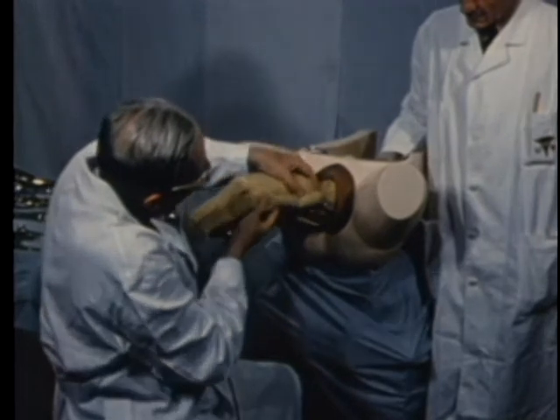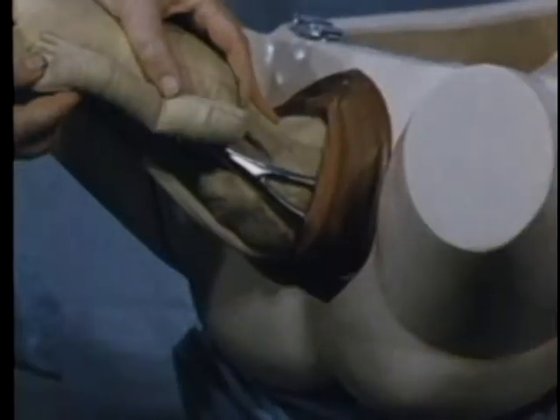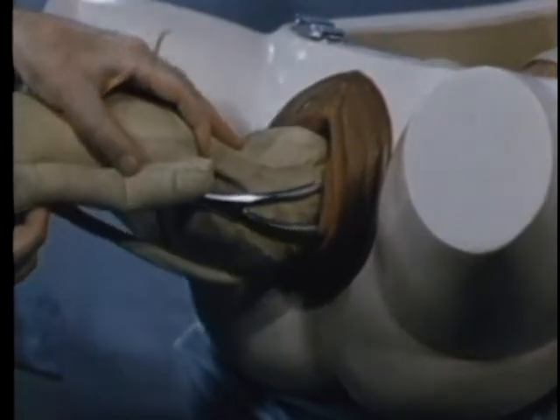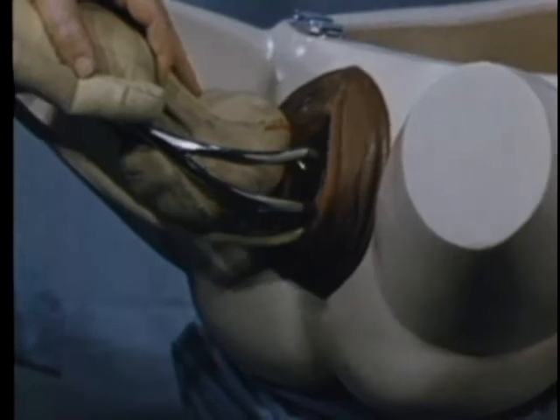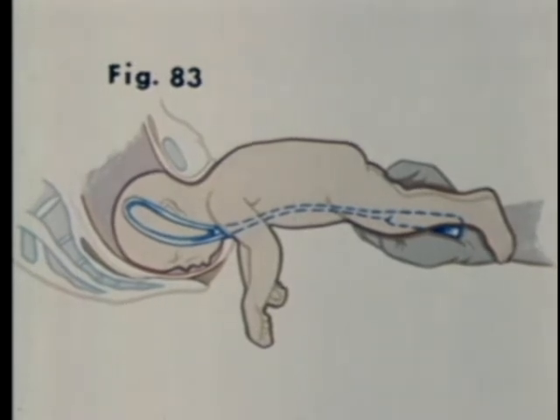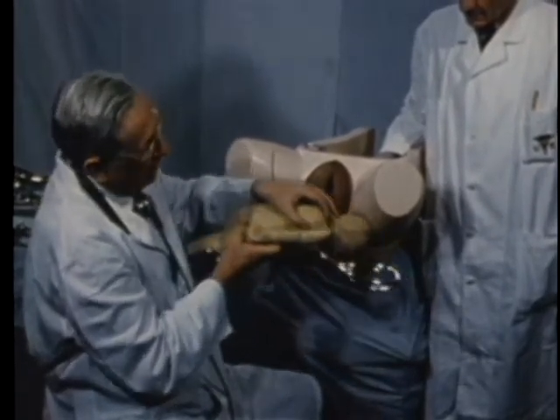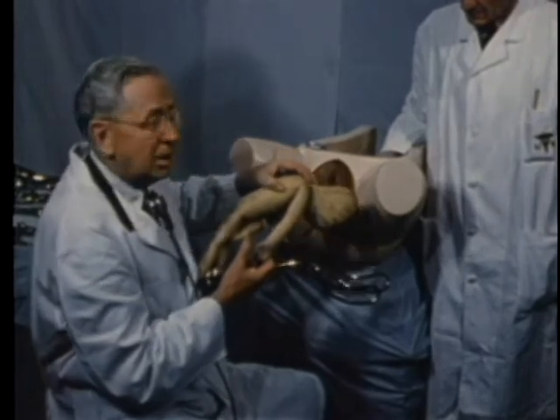Eventually, the head is flexed so that it can be withdrawn directly from the vulva. Gently, without any explosive exit, with the blades still in place. The advantage of holding the thigh on against the handles prevents the head falling through the forceps once it has left the vulva.